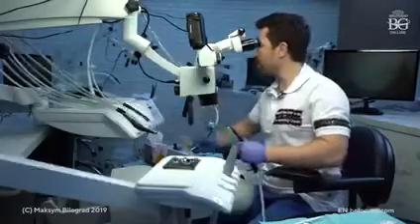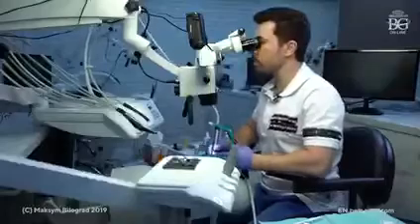But at really low speed, you may feel by tactile sensitivity if your finish line is rough, if your finish line is jumping, your burr is jumping over the finish line. Okay, so that's why we use also this speed, not just not to overheat, but also for having tactile sensitivity. Okay, so let me just modify or improve the finish line if it is necessary.